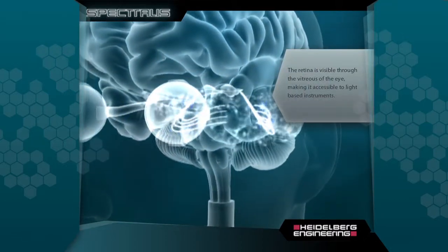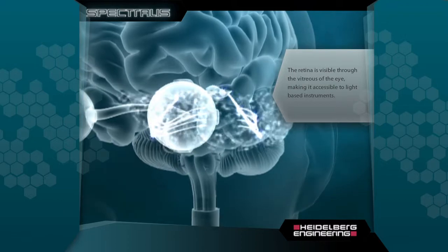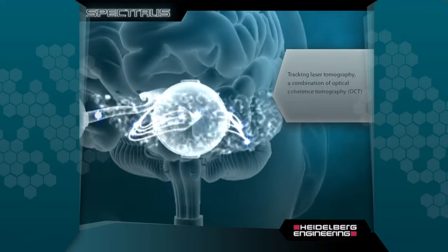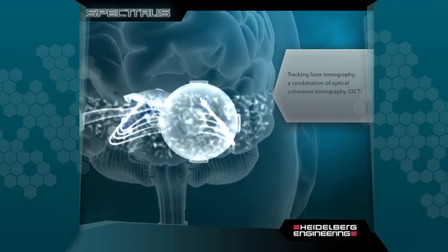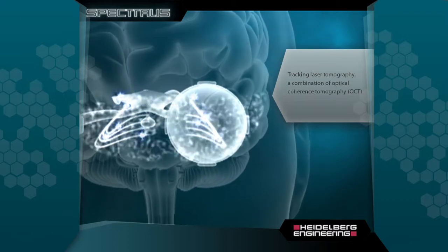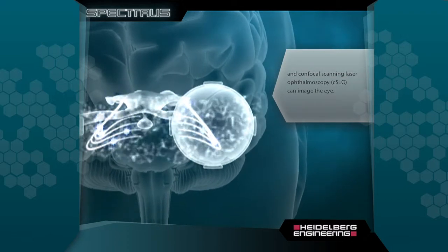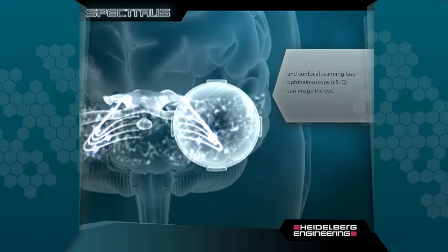The retina is visible through the vitreous of the eye, making it accessible to light-based instruments. Tracking laser tomography, a combination of optical coherence tomography and confocal scanning laser ophthalmoscopy, can image the eye.